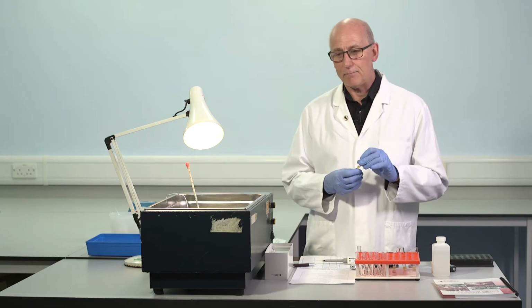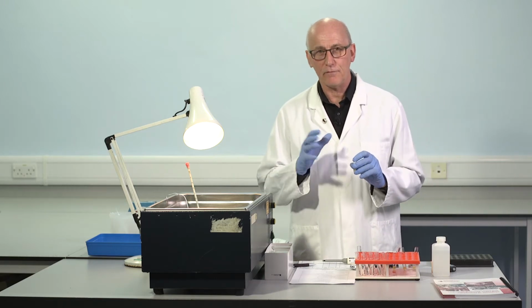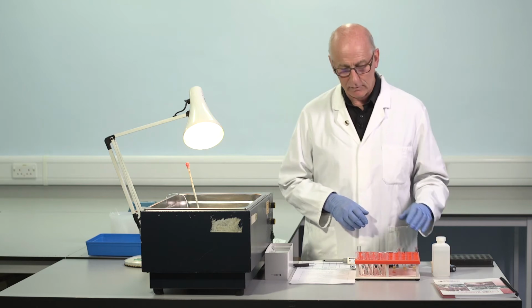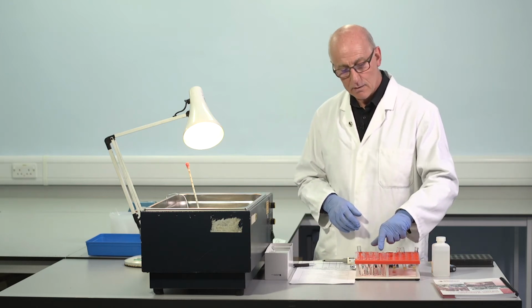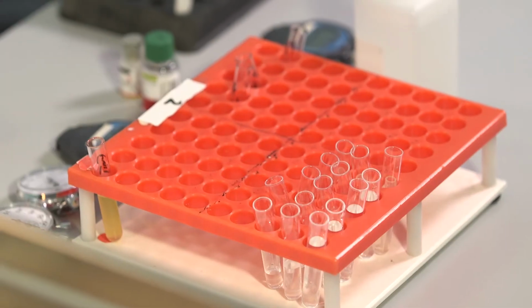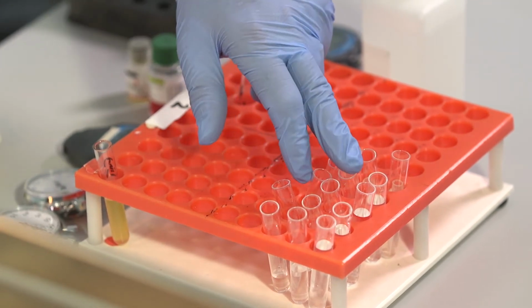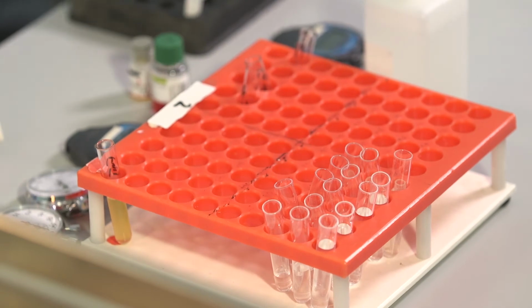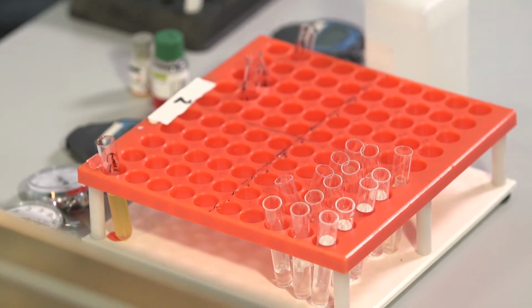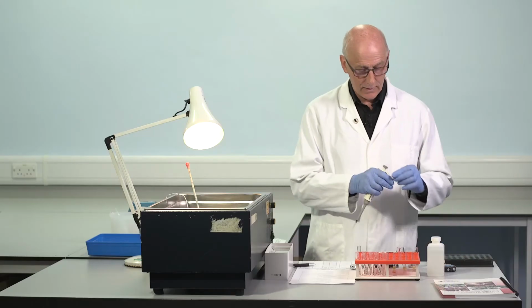So we have here an internal quality control sample, and we should treat this now very much the same as the standard material. So same plastic tubes, the same volumes of diluent, the same diluent, Owren's buffer. 900 microlitres, 0.9 of a mil, 1.9 mils, 3.9 mils. And we're going to add 100 microlitres to each of those. So 3 dilutions of the control, just in the same way that we made 3 dilutions of the calibration for the initial calibration curve that we'll talk more about later.